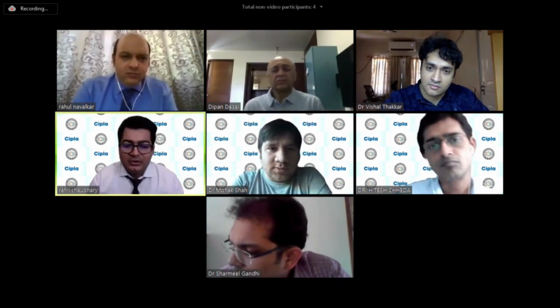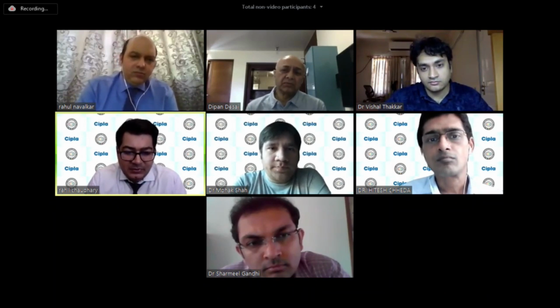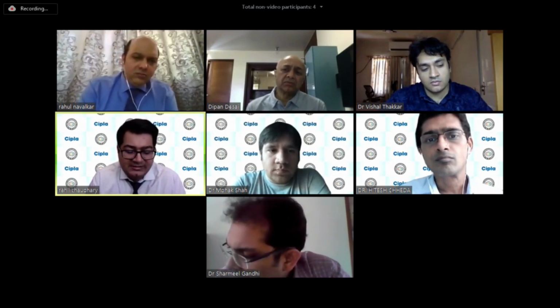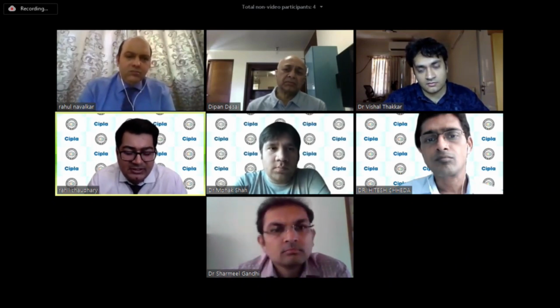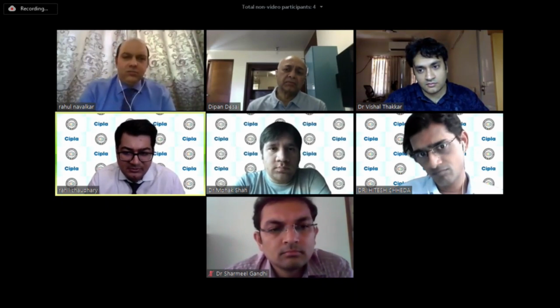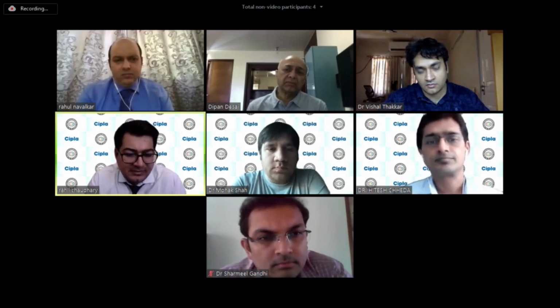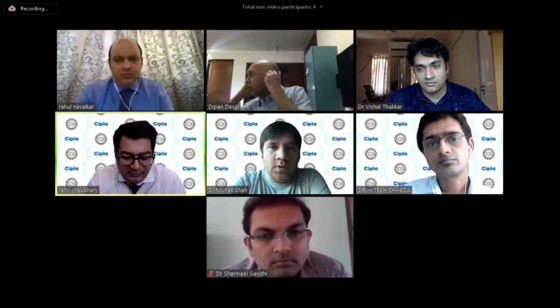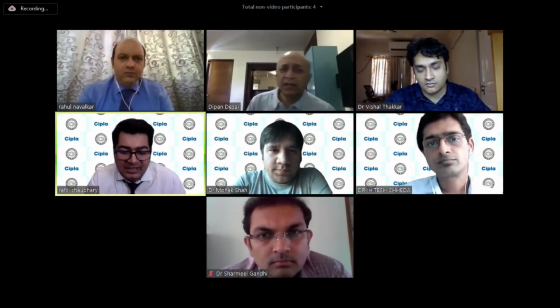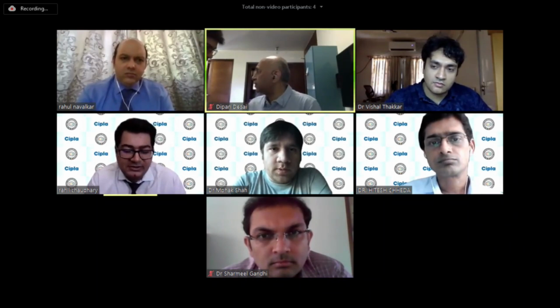They both are equally good. They both give excellent results. The advantage I find with the Lensar is that you have an immersion technique, compared to the Lensx where you have to use a soft contact lens. Sometimes with the immersion technique, the results I feel are better because it avoids even the minutest distortion, which can sometimes change the final outcomes. So I feel that is a better thing. But practically, both give excellent results. There are absolutely perfect results with these technologies.